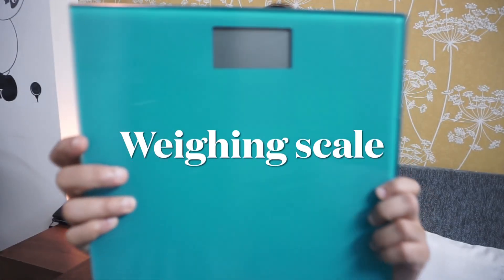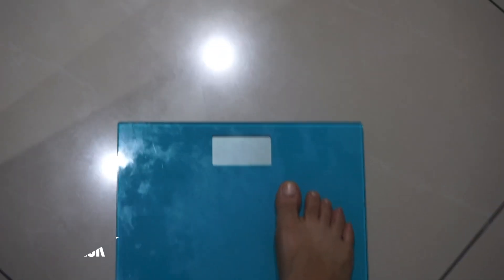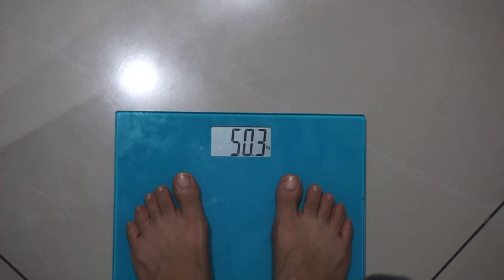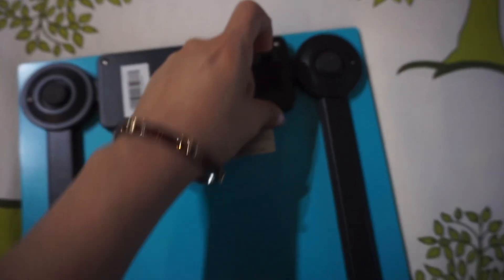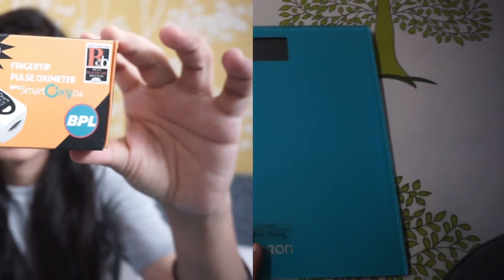The next device I have is this one from Omron — it is a weighing machine. Nowadays I don't get to see that one-rupee coin weighing machine, so I prefer keeping this one at home to keep a check on my weight. I have been using this for almost more than three years.